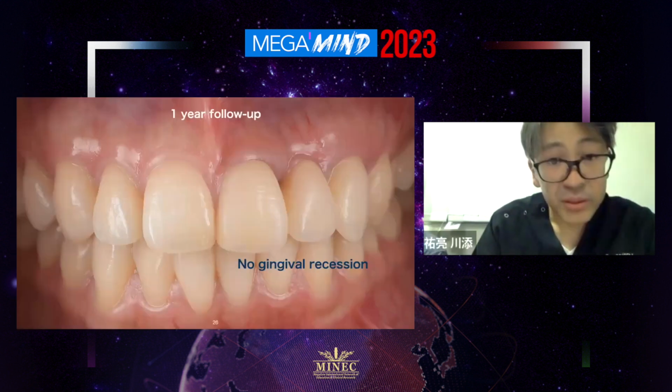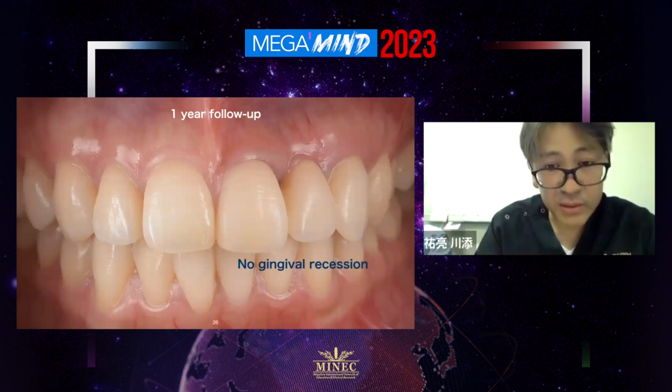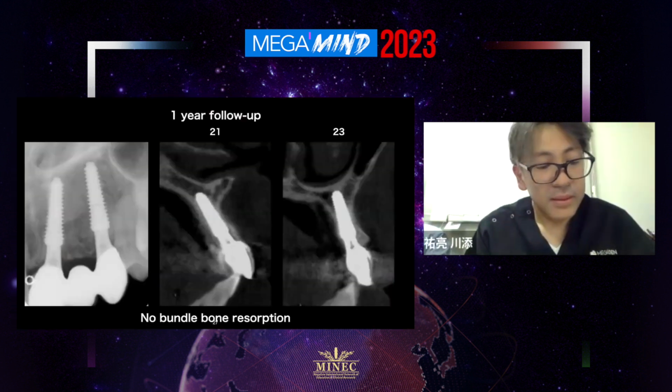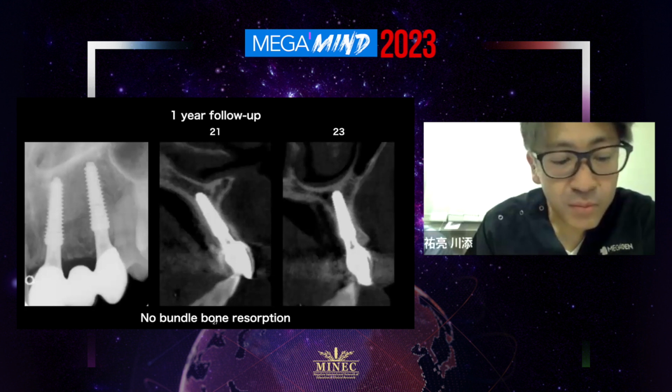One year after surgery, there is no gingival recession and the aesthetic appearance is maintained. These are 1 year follow-up X-rays. No marginal bone loss or labial alveolar bone resorption was observed.